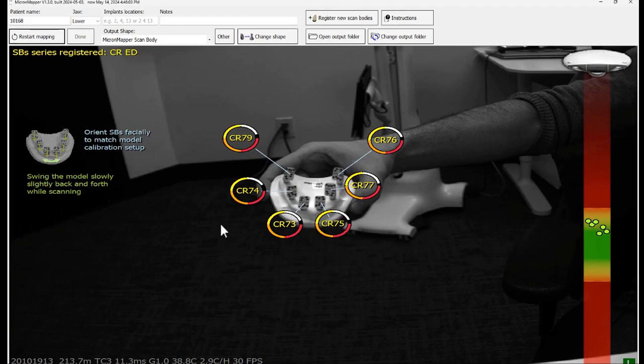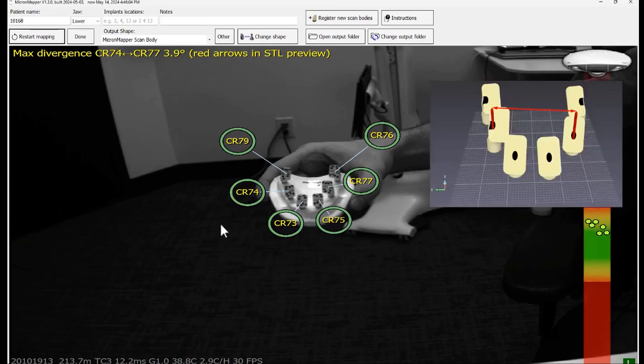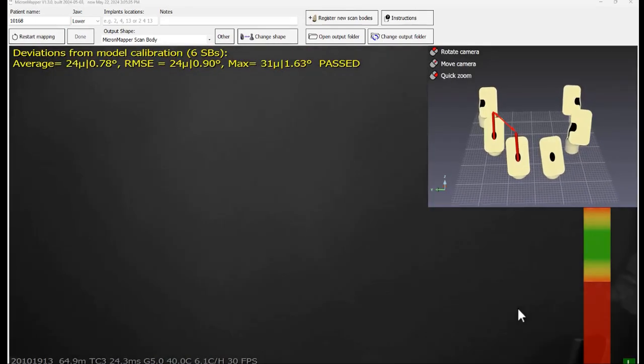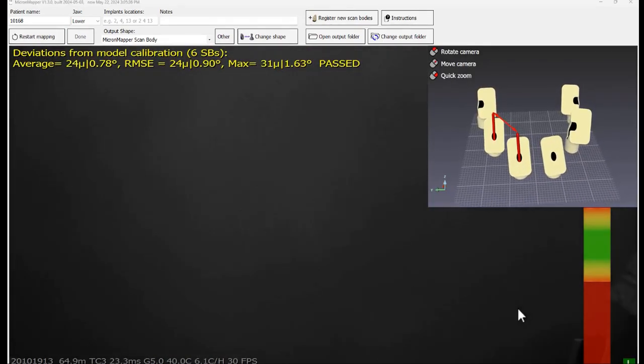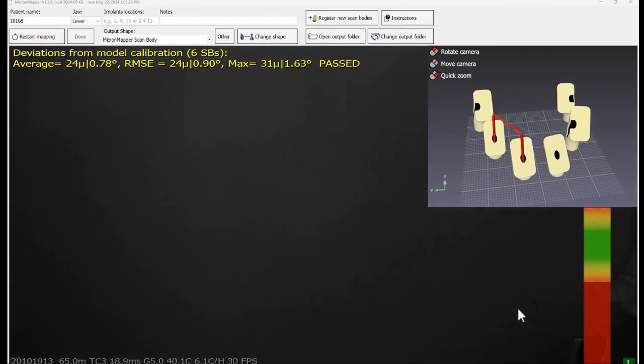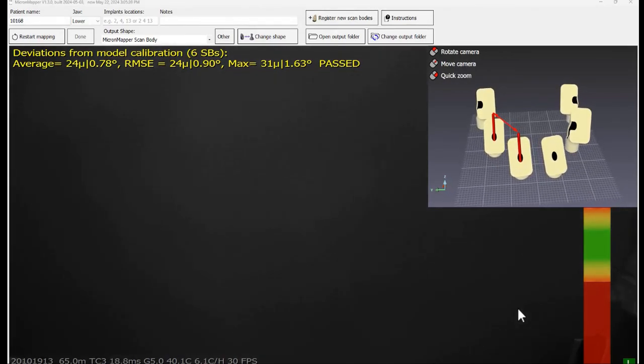Once all the scan bodies circle turn green, a message appears on the screen stating the result of the calibration. Make sure you're getting a pass result.